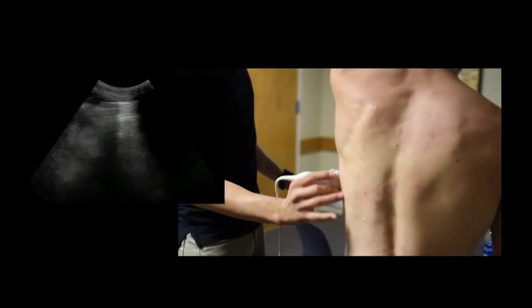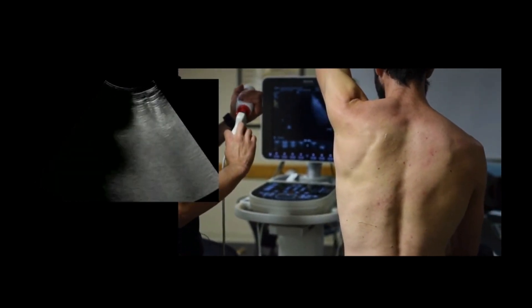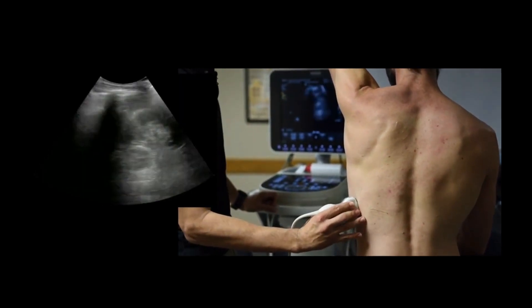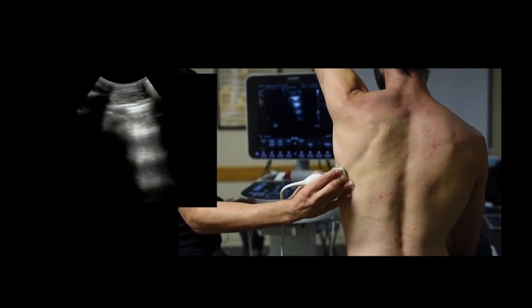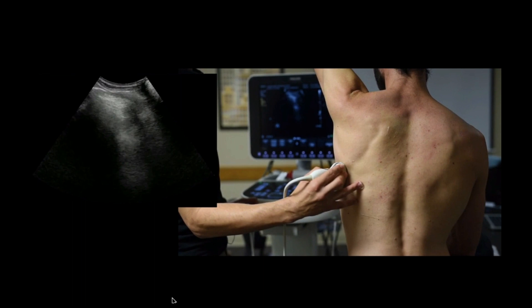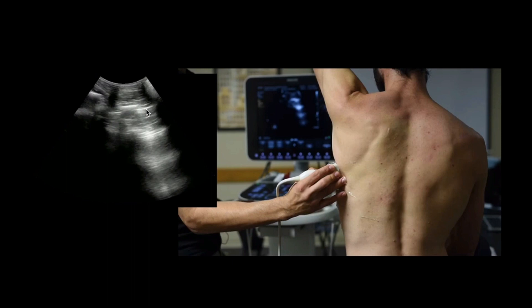When I'm done looking at the posterior segments, I have the patient place their arm on or above their head and do the same thing from the posterior axillary line to the anterior axillary line. Same technique — find the most inferior portion of the lungs, find that line, then lawnmower back and forth in between the ribs. I usually have the probe marker facing up toward the patient's head, focusing on that pleural line and looking for any defects in it.